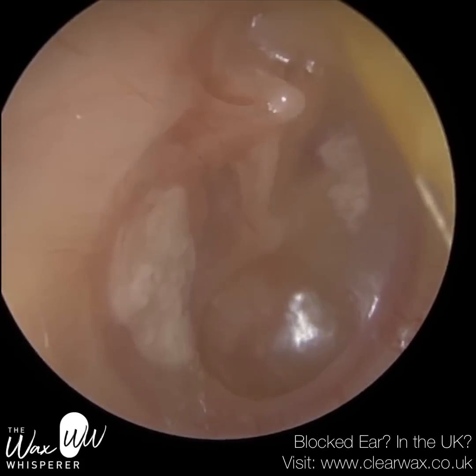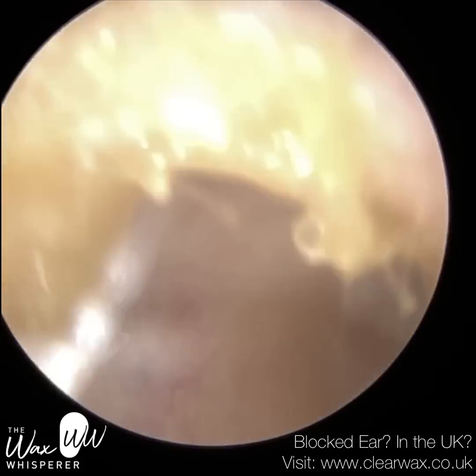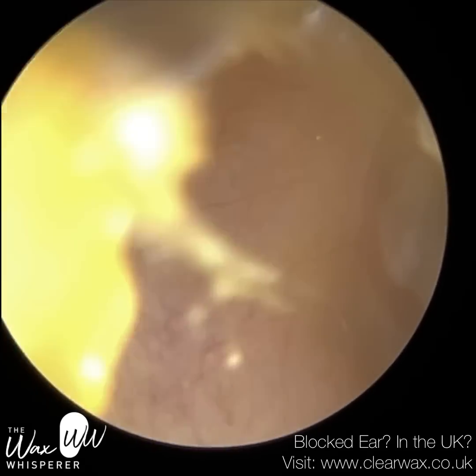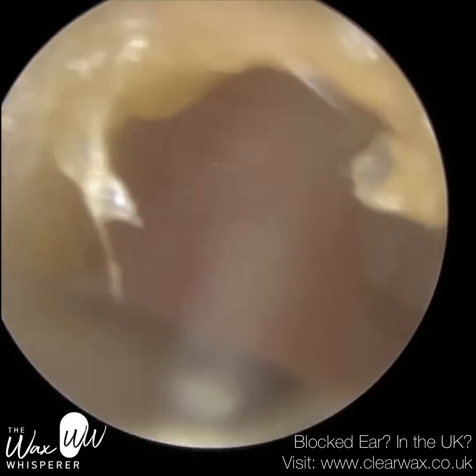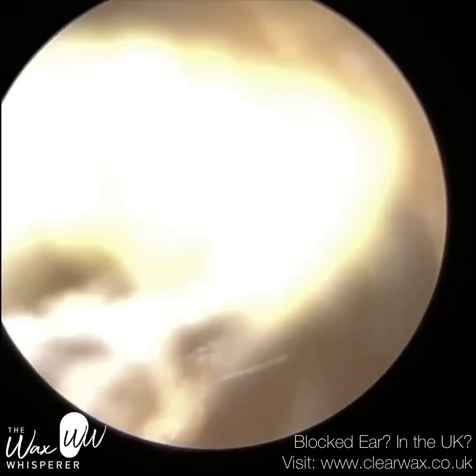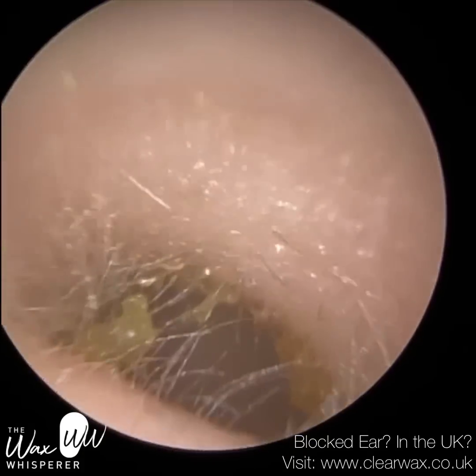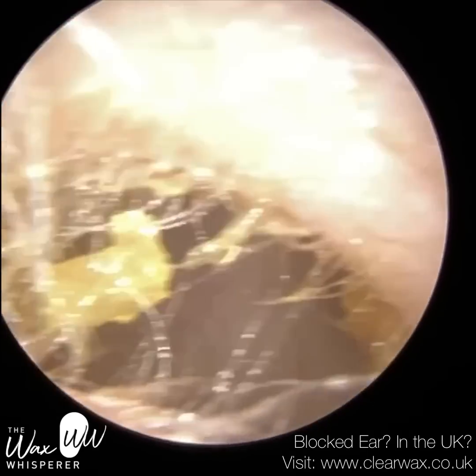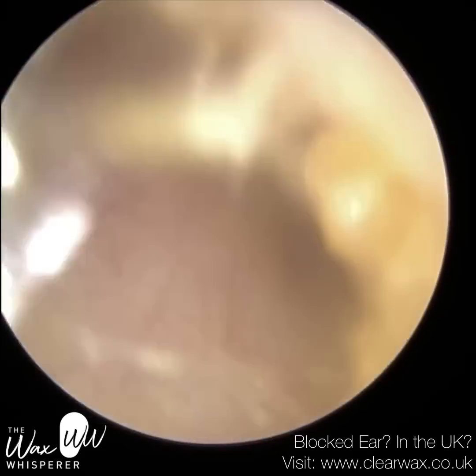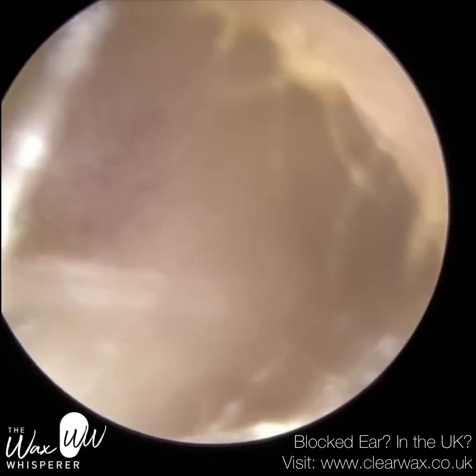The top part of the ear canal near the eardrum — the scutum — has been eroded. We call that an auto-aticotomy, which is revealing the neck of the hammer bone. The hammer bone, also known as the malleus, has a main branch called the manubrium, which is attached to the eardrum at the centre — a place we call the umbo. Then we have the neck of the malleus, which goes upwards into the middle ear. We don't normally see that, but because the scutum area has been eroded, it has revealed the neck of the malleus. You can also see a subsection of the head of the malleus.